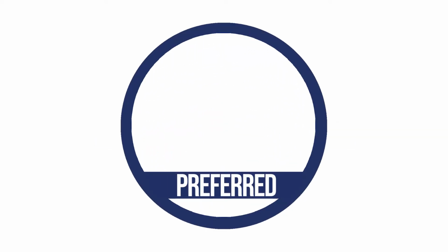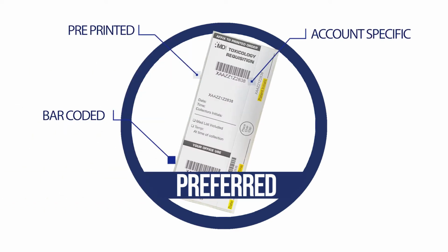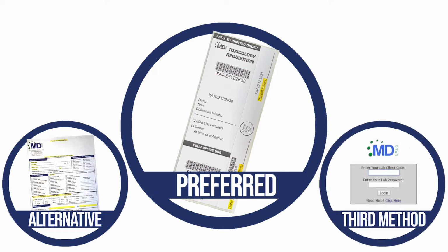Depending on how you will be submitting the requisition to MD Labs, you will need to have the appropriate requisition supplies. The preferred method for submitting a requisition is using pre-printed account-specific, bar-coded toxicology requisition stickers with a chain of custody label. This is the simplest method for submitting a requisition. An alternative method is using the toxicology requisition form with chain of custody label at the bottom. And the third method is by using the eRec system via the MD Labs portal with a label printer.